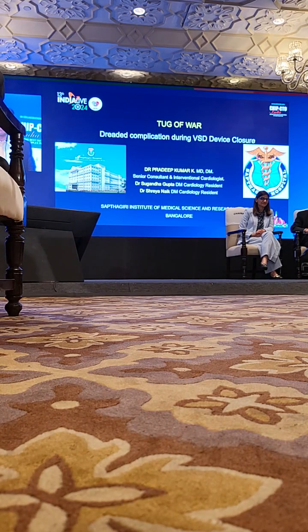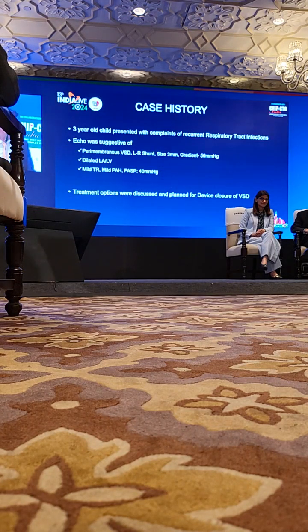I am Dr. Pradeep Kumar. I will be presenting this case on behalf of my fellow resident, Dr. Sugandha Gupta. Tug of war, dreaded complication during the VSD device closure. Very similar to the previous case, but all iatrogenic complications don't end up with happy endings.